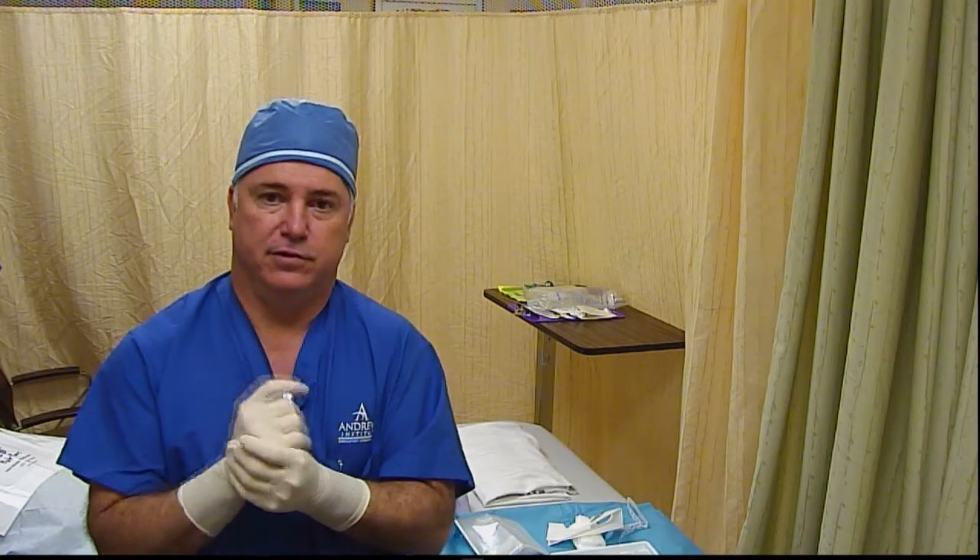Hi, this is Dr. Greg Hickman again for the Block Jocks Block of the Day. Today we have a 25-year-old NFL 5-year veteran wide receiver. He's 6'4", 200 pounds and a very proficient wide receiver. He had his right shoulder operated on about 6 weeks ago and did very well with his continuous catheter and bupivacaine infusion for his post-op analgesia. We're going to do the same thing for his left shoulder today — he's having a labral repair and possible rotator cuff debridement, and he's pretty excited to have his pump.